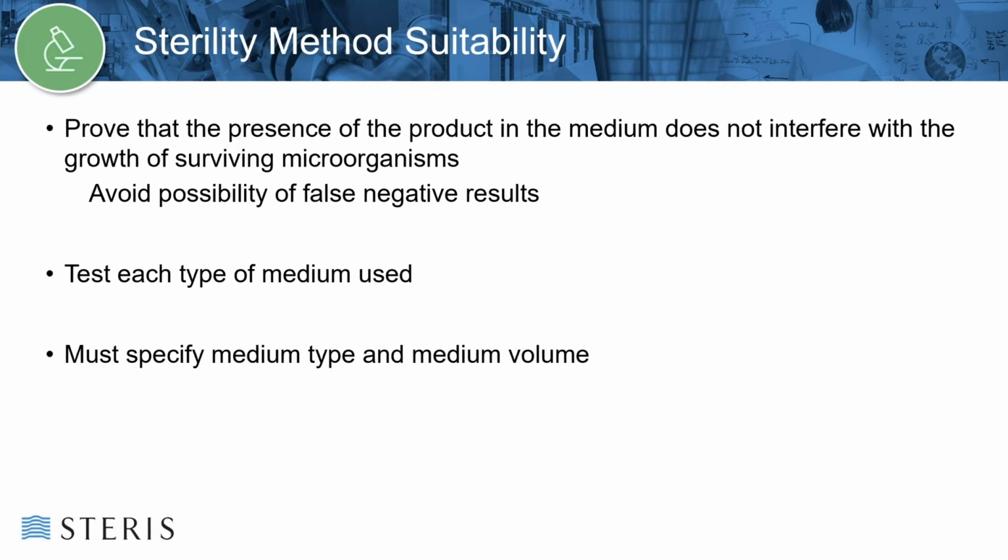Large and complex devices create testing challenges, as extensive manipulation and handling increases the potential for incidental contamination. It is best to provide the testing laboratory with an assessment sample to develop a plan for testing prior to sample submission.